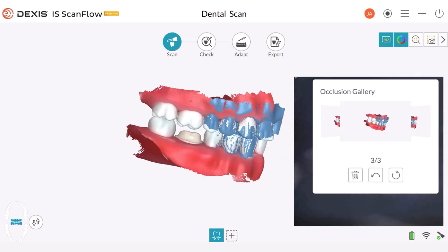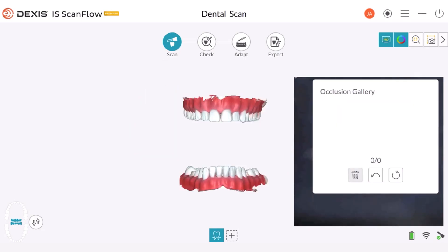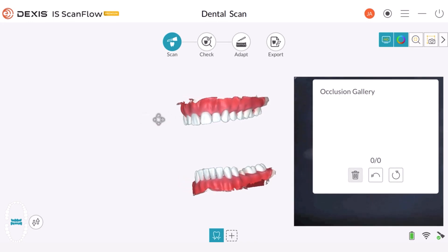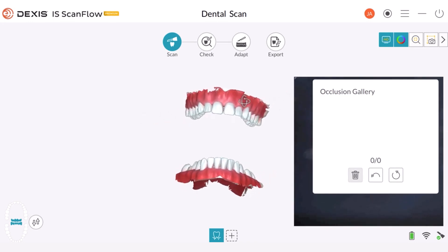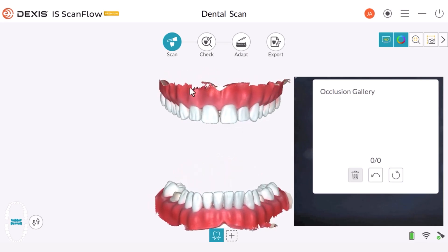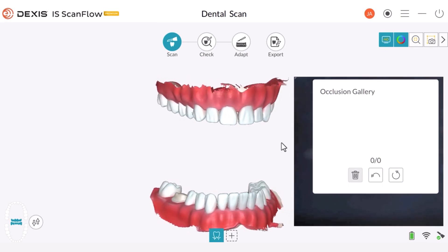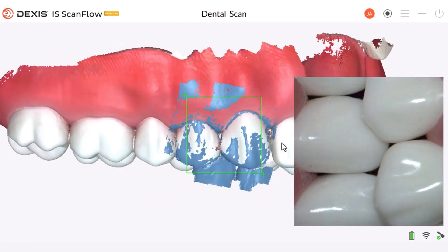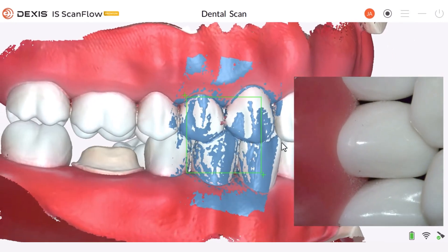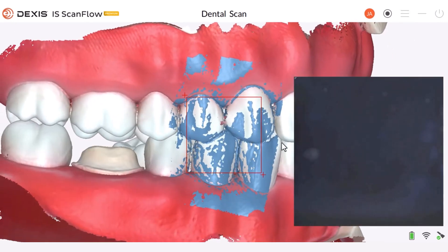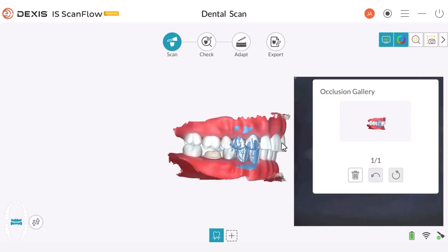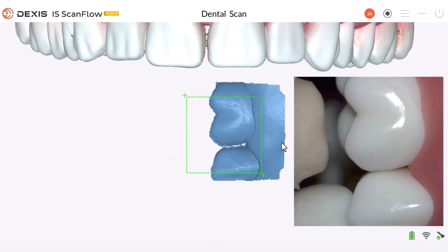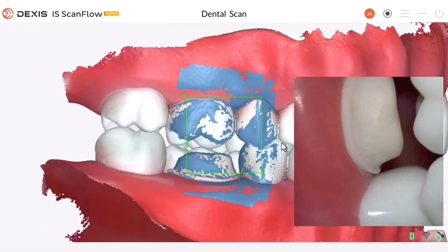Now let's look at a full arch scan. As seen here, the buccal surfaces are well defined. Instead of taking three buccal bites across a quadrant, we'll take four buccal bites — two on each side, premolar and molar. Place the scanner on the buccal surface of the premolar and glide the scanner up and down to bring the arches together. Wait until the buccal bite appears in the occlusal gallery before acquiring the next bite. We will now move the scanner a little more distal and glide the scanner up and down until the arches come together.